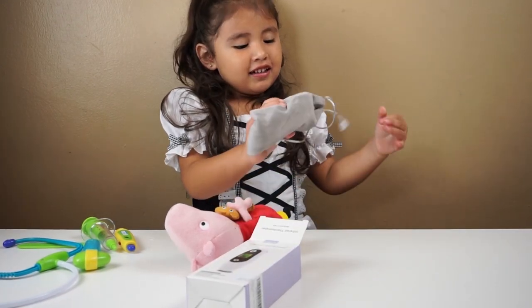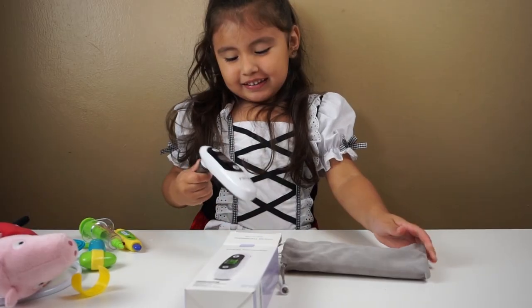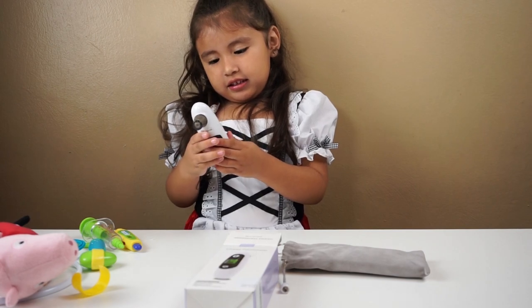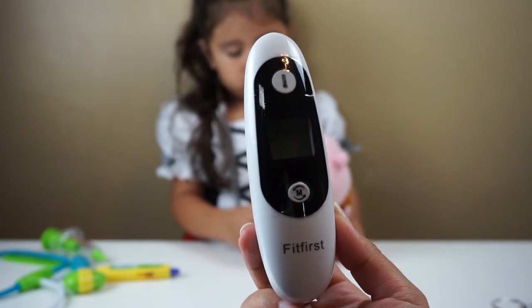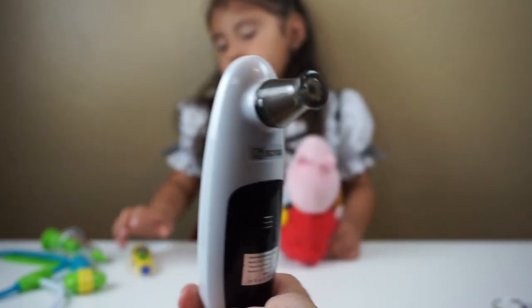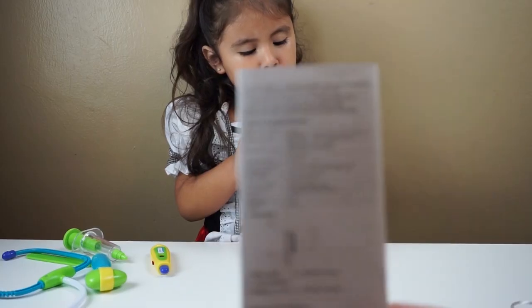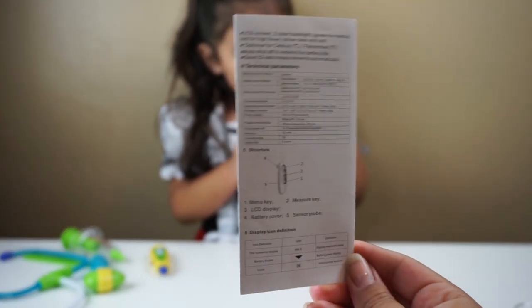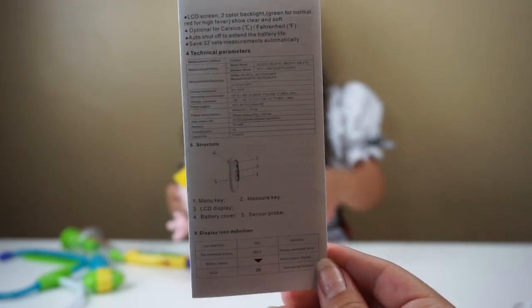I love the packaging. Let's open it. Let's see. So cool. It also comes with the instructions. I was just looking at them and they're very easy to follow. It tells you step by step what to do.